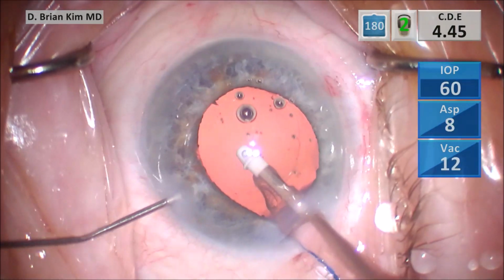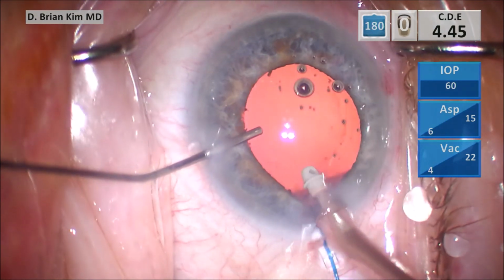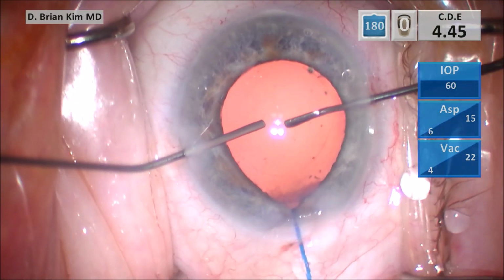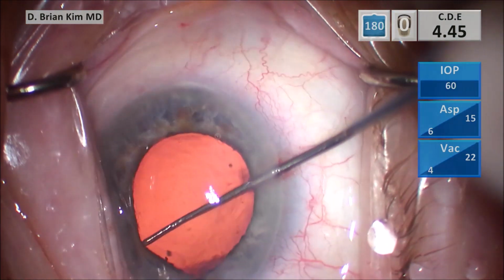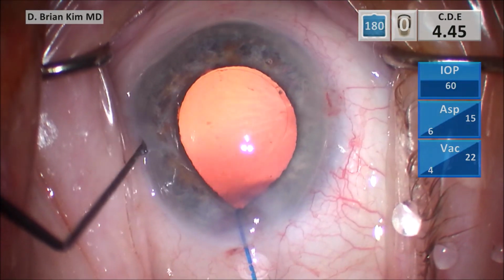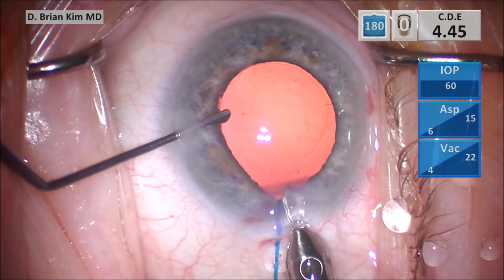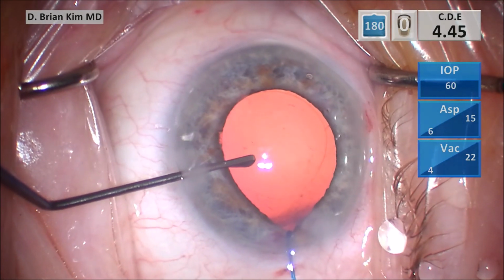I'm really compulsive about cleaning up the bag. I don't want to have this patient come in years later with a giant Soemmering ring or capsule phimosis. So I come out and I push cohesive viscoelastic to fill the bag, and then I'm going to polish the lens epithelial cells under the rhexis edge, first on the left side and then the right side. You can see the single subincisional iris hook has been really a game changer for this case. This patient is not going to have iris trauma or transillumination defects or worsening potential post-op iritis from all that iris trauma.